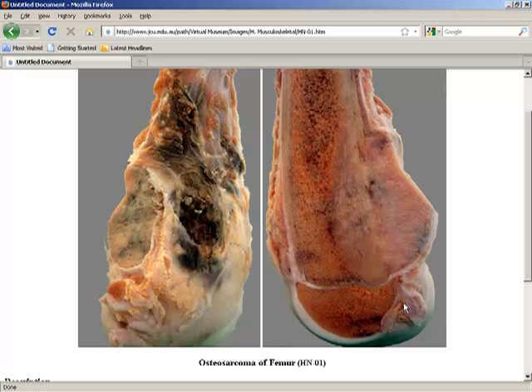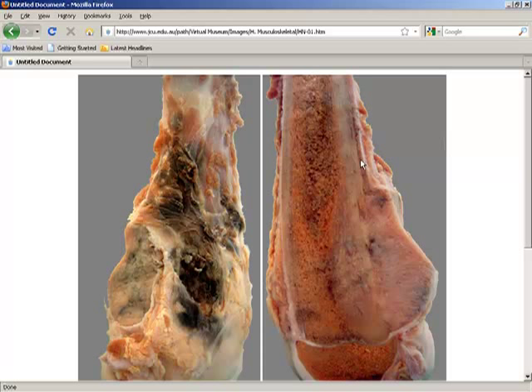Usually it does not involve epiphysis. And see the tumor and raised periosteum. Okay, see that's the periosteum. The periosteum has been raised here and the tumor is here. So at this angle here, the cortex is thickened. That is Codman's triangle, usually you see it on the X-ray. A reactive bone formation at the elevated periosteal surface. Again, that's a feature of osteosarcoma.